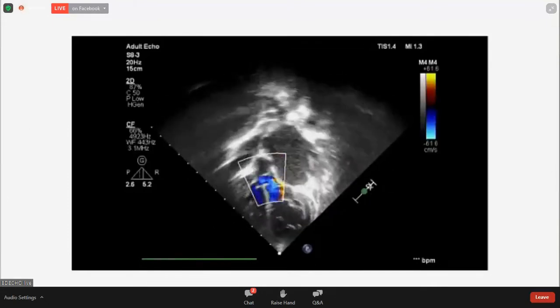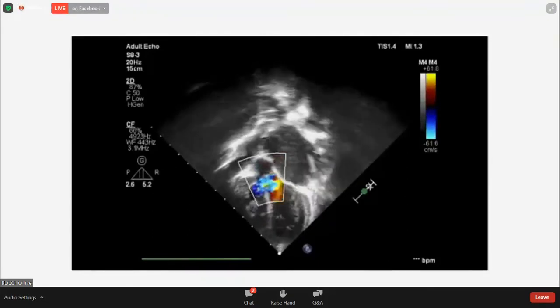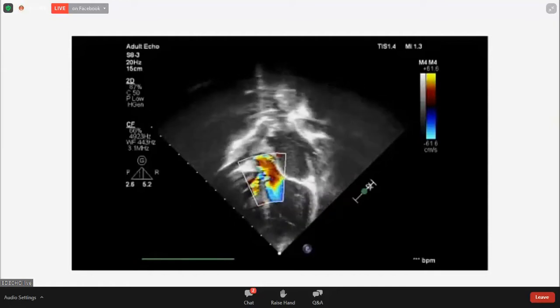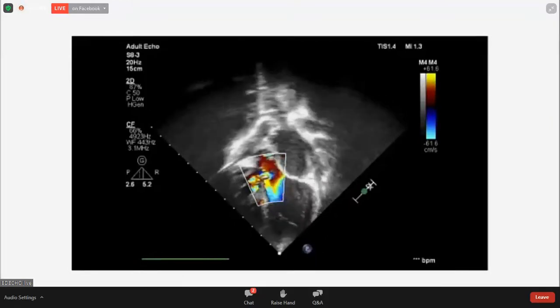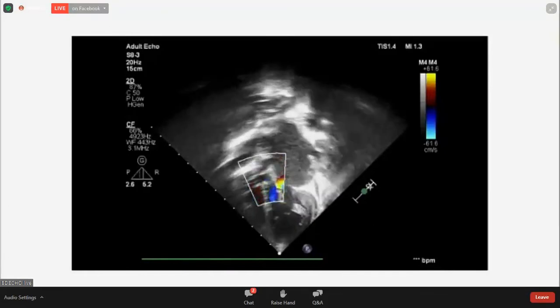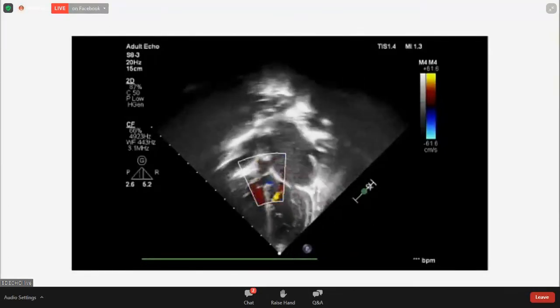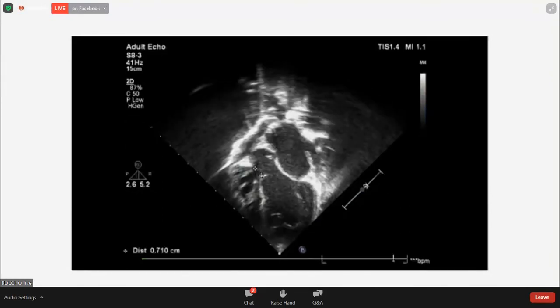Now, color flow interrogation in the apical 5-chamber view shows there is a VSD shunting left to right. You can also see a spur of tissue from the ventricular crest that is projecting into the LVOT, producing LVOT obstruction, and that gradient was 30 millimeters of mercury. So this is VSD with mild LVOT obstruction caused by a subaortic membrane. And this is the VSD, about 7 millimeters.